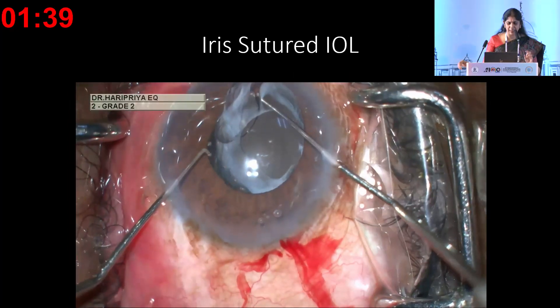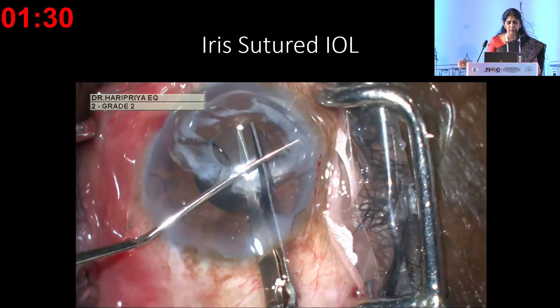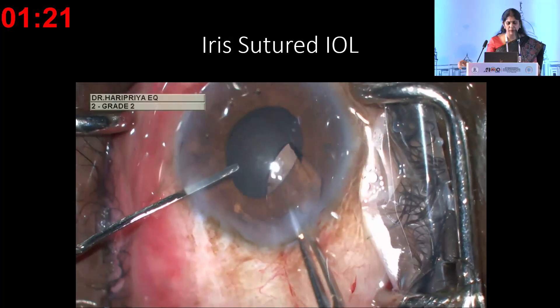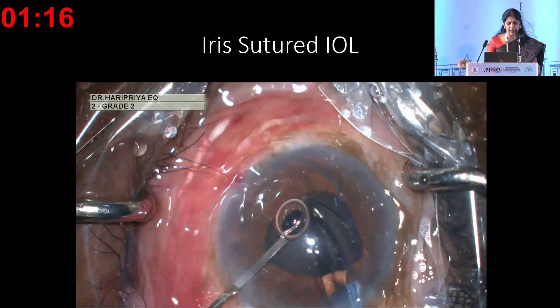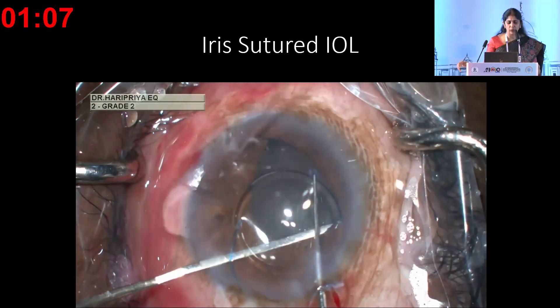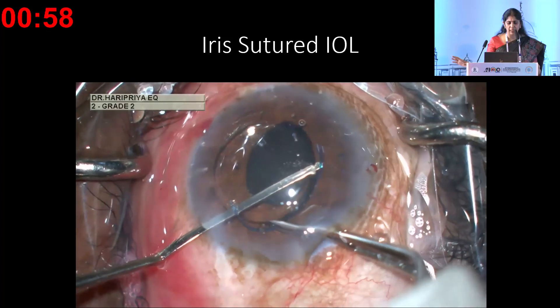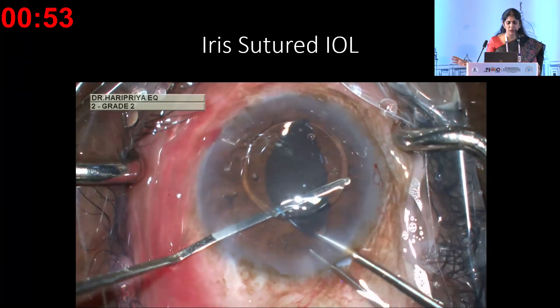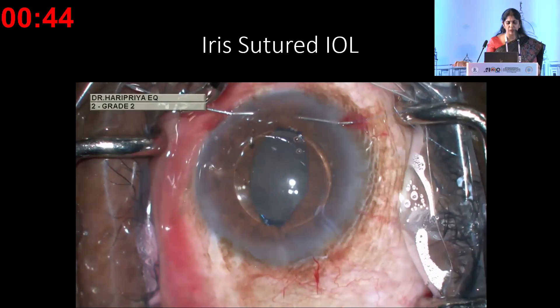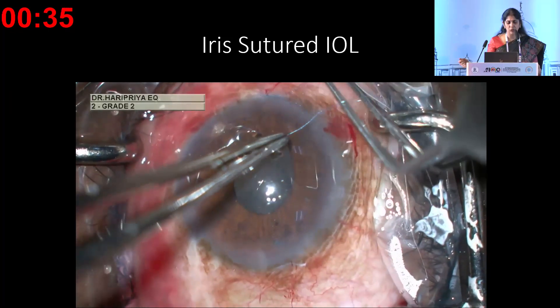As a variation of iris fixation with a three-piece IOL: this patient had a contracted capsular bag and IOL due to retinitis pigmentosa. Through a three-millimeter incision, the existing IOL is cut and a new three-piece acrylic IOL is placed in the anterior chamber. A sensor IOL is preferred because its anterior surface is rounded. The leading haptic is tucked behind the iris, the optic remains in the anterior chamber, and a cyclo-dialysis spatula supports it from below while the trailing haptic is tucked under the iris—achieving optic capture. The spatula is critical; once fixation is in place, sutures are applied by taking a bite below the haptic and suturing both ends on each side.